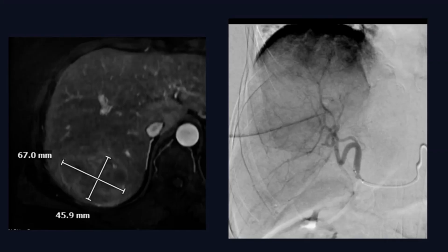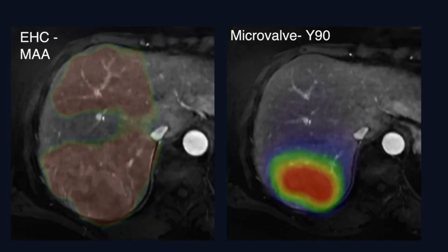If you look at my first conventional angiogram, I think you can see it there. It definitely is enhancing, and so we thought we were good to go, just an end hole catheter. So we infused our MAA. And if you go to the next slide, we kind of freaked out, because at our MAA we just had no preferential uptake to the tumor. The uptake was into the background liver. T to N ratio is essentially 1, where we just didn't see anything in that large tumor.